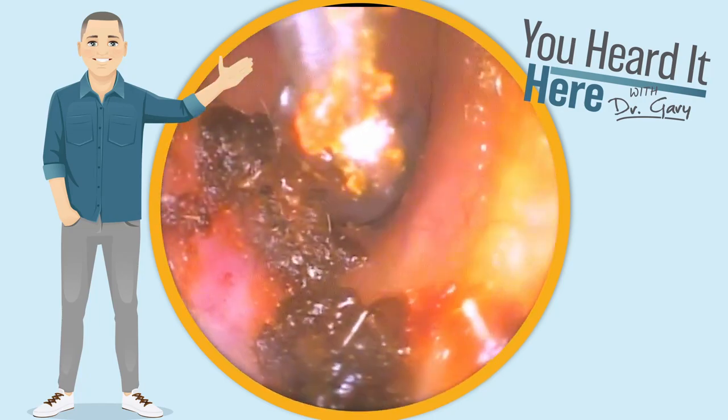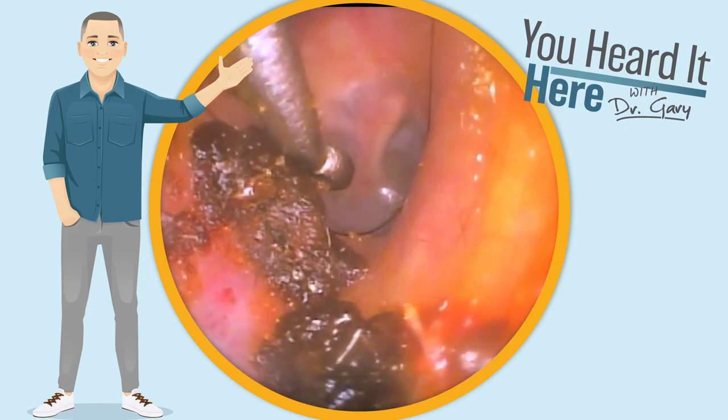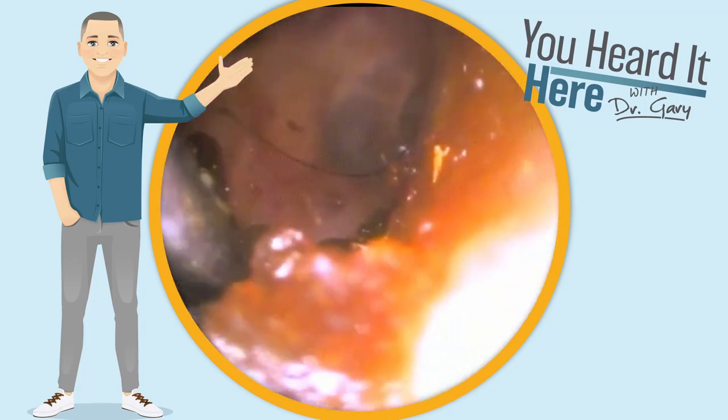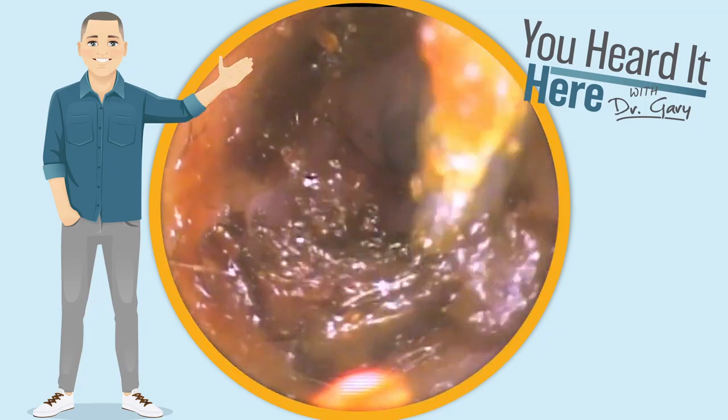Turn the curette around here to be able to pull that wax away from the wall. As everything comes out, we'll get a nice view of the eardrum. Clean up these side walls, and then the patient will be good to go.